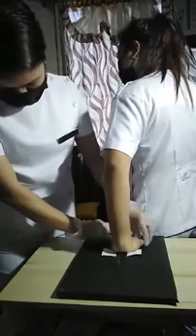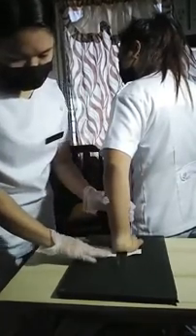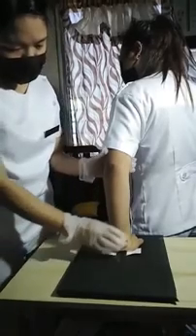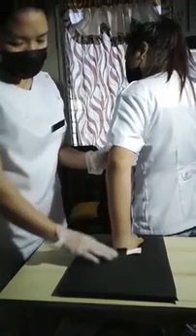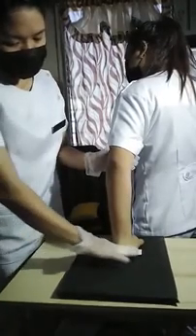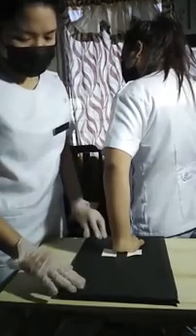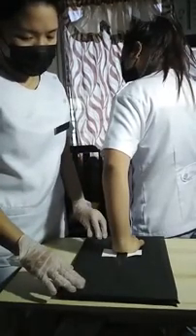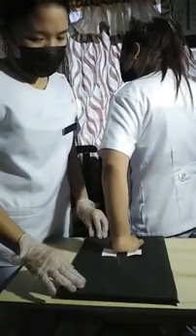The central ray, tangential to carpal canal and directed at mid-carpal area and perpendicular to the image receptor, or angled towards the hand approximately 20 to 35 degrees from the forearm's long axis. Purpose and structure shown, an alternate method with similar result to the Gaynor-Hart method.